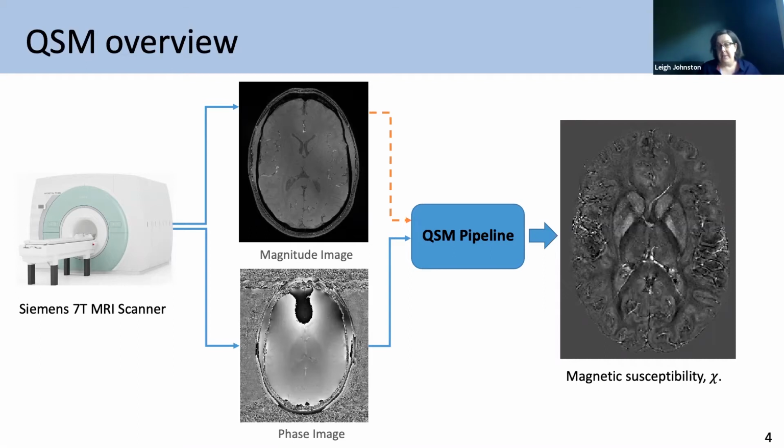People get really excited about this as neuroscientists, this idea that you can image iron, but we have nothing that actually says, well, that is iron, this is ferritin of a particular type, and that voxel next to it isn't. All that we can say is that we have an estimate of what the magnetic susceptibility is. So I am very keen always to point out the limitations of the methods, and this is a limitation. I cannot actually say we are directly measuring iron, but there have been plenty of studies to show that there's definite correlation. For example, early studies showing histology images with plaques located and showing that they co-locate in terms of an MRI scan. Okay, so we've got a pretty good idea that that's what we're looking at.